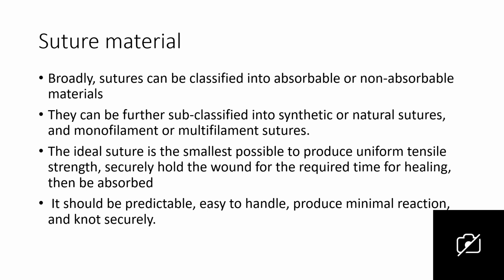Suture material, again, is broadly classified into absorbable or non-absorbable material. That means with absorbable, you don't need to come back for suture removal. With non-absorbable, you need to come back for suture removal. They can be further subdivided into synthetic or natural sutures, and monofilament or multifilament sutures.